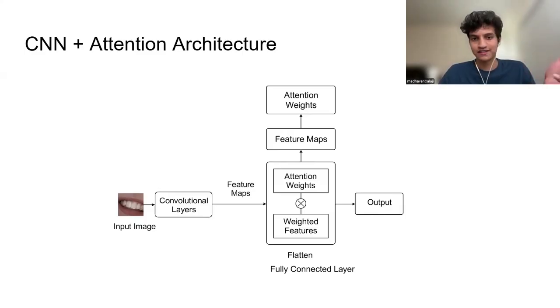The image features are then flattened and passed through a fully connected layer. This is where the model takes its final decision: this looks like caries, or this is a healthy teeth image. Since the model is not distracted by noise, it becomes more accurate and reliable. With attention, we can even visualize where the model was looking when it made its decision, making it more trustworthy.